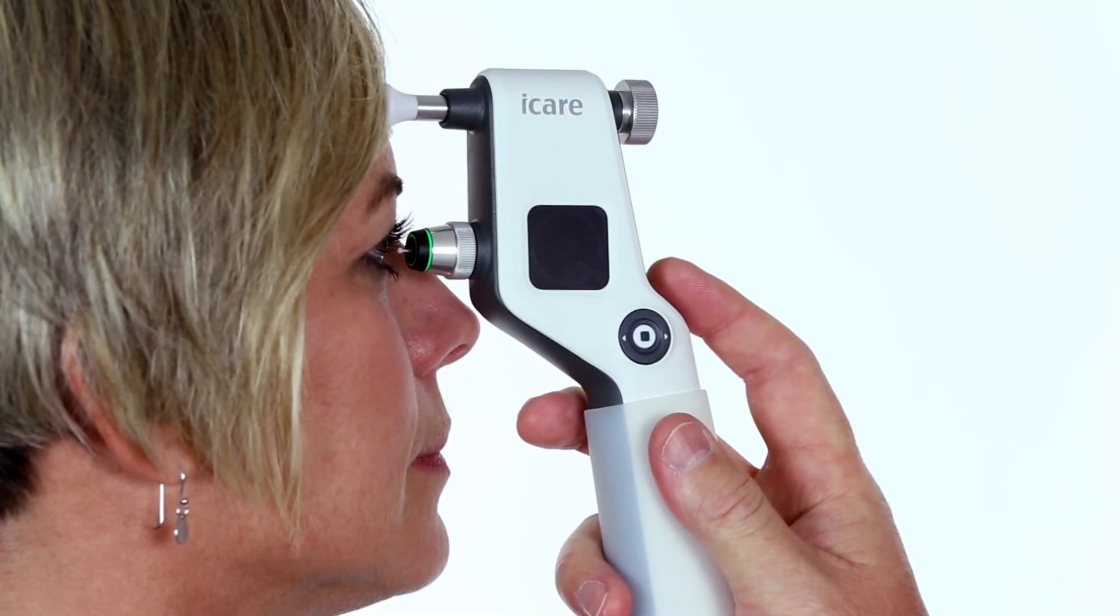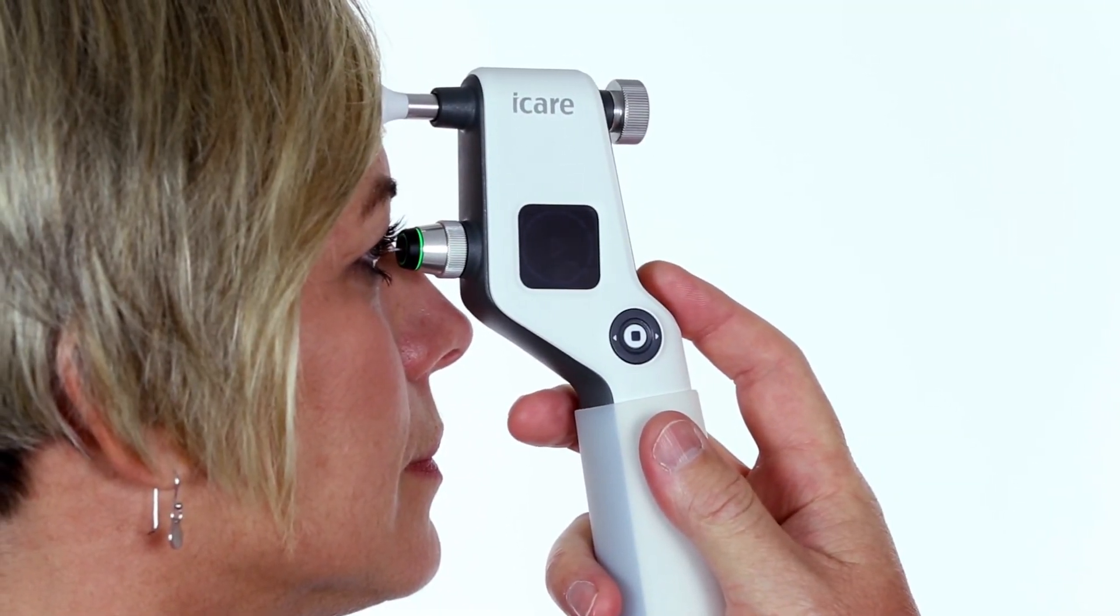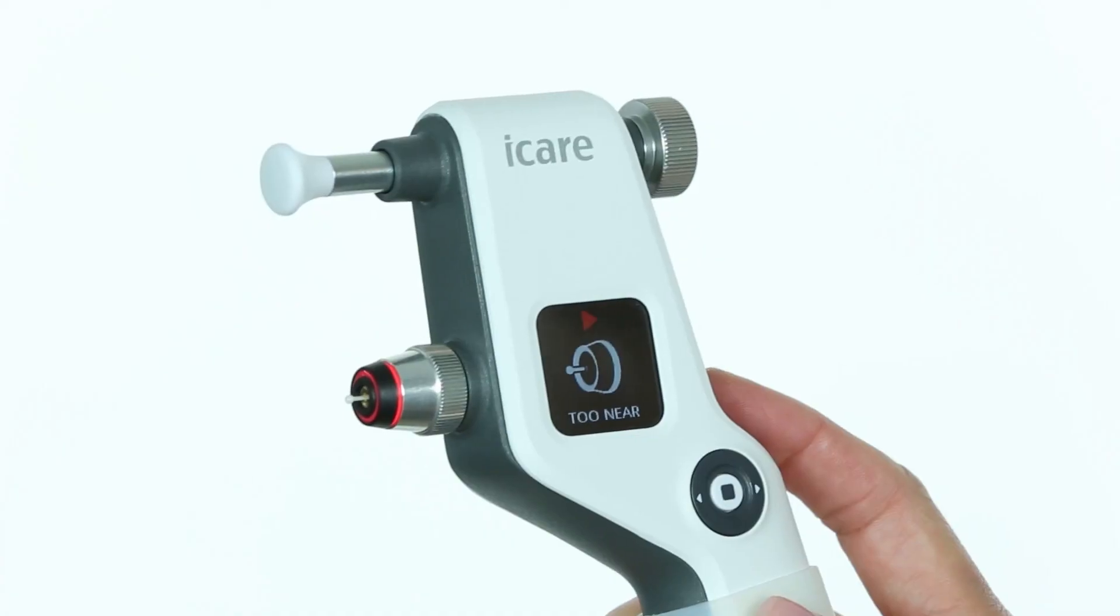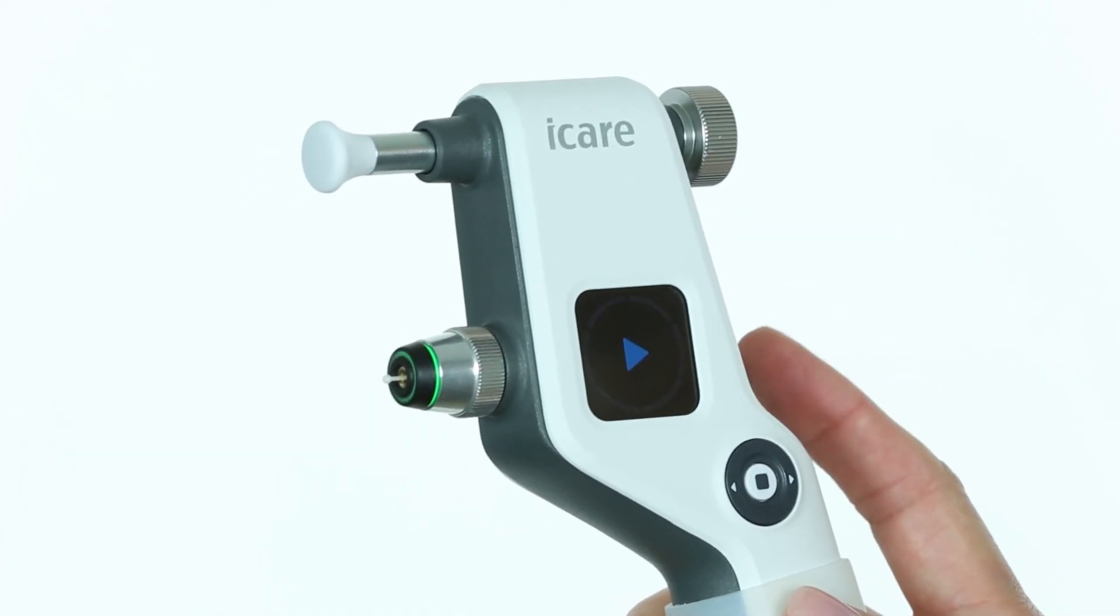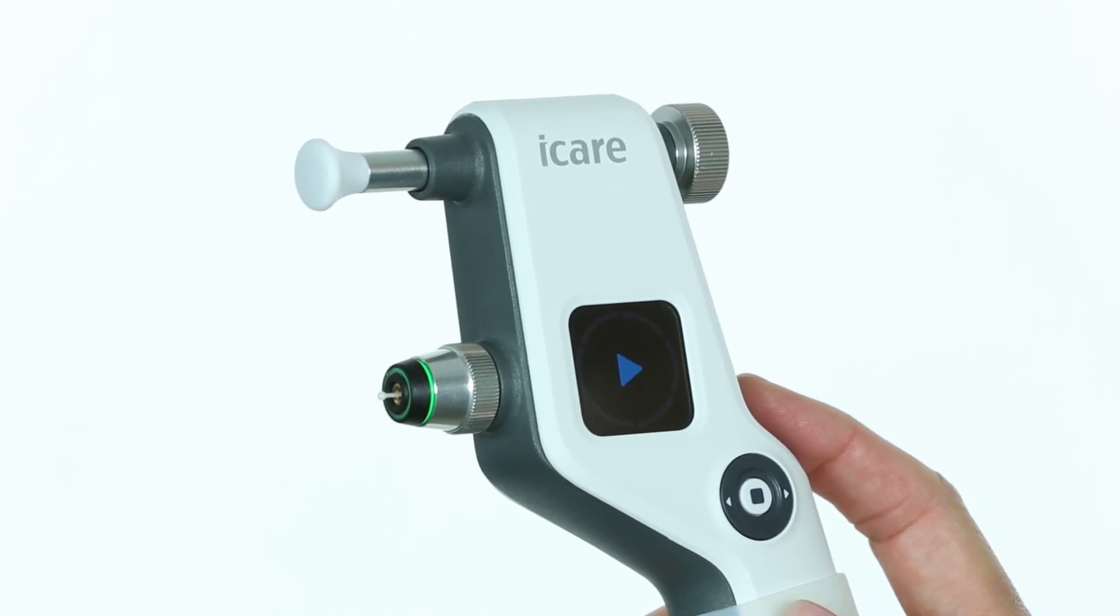Error messages: For example, if you are too close to the cornea, the too near error message will display and the probe base light flashes red. Clear the error message by pressing the measure button once.